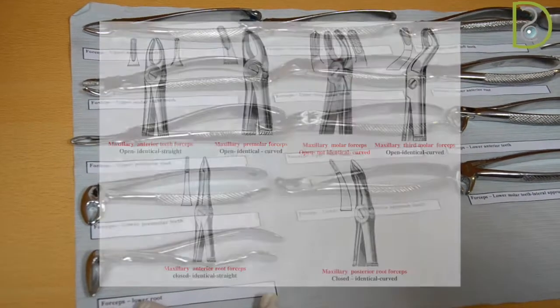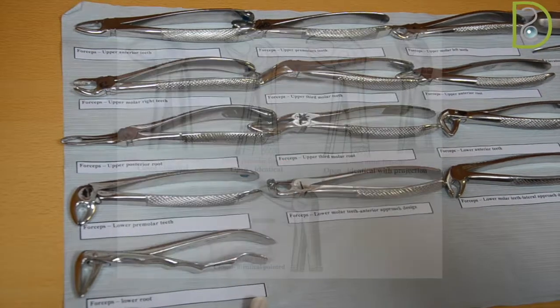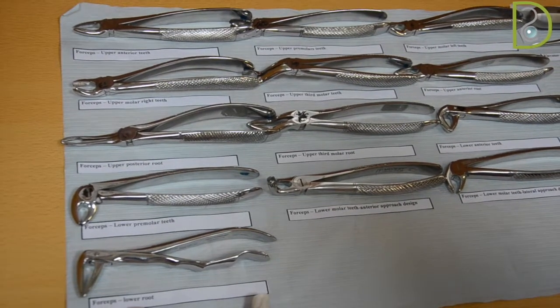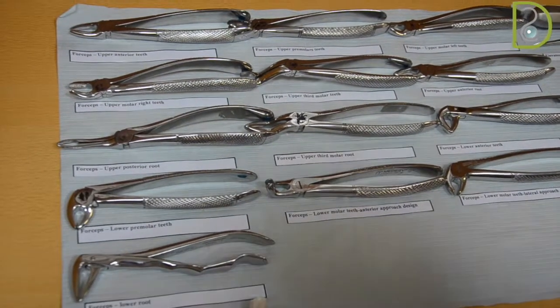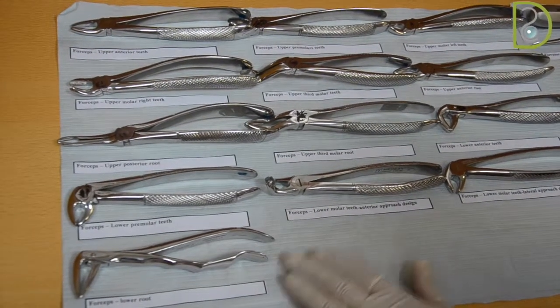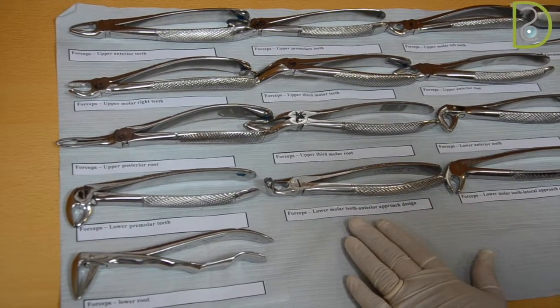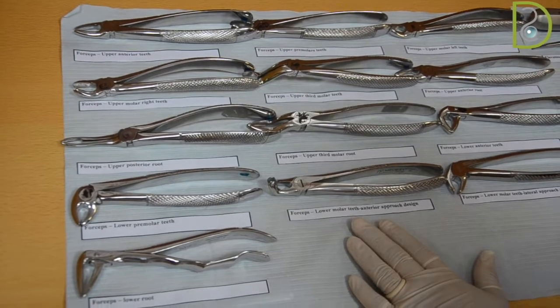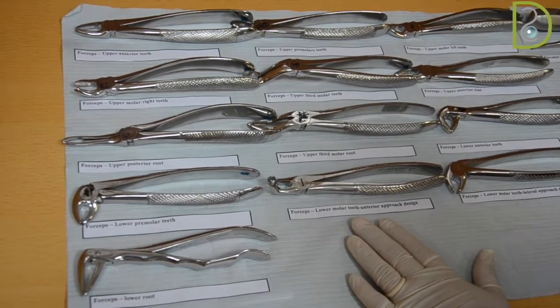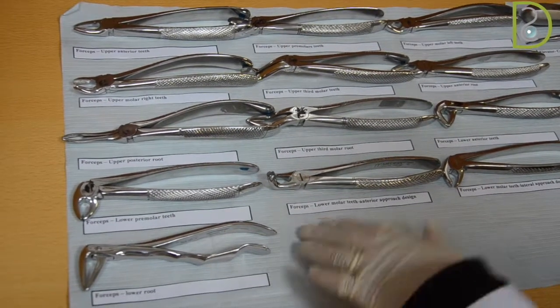Hello students, and welcome to this session to demonstrate surgical instruments used for extraction of teeth. Most closed technique extractions are going to be done by majorly these instruments, but not limited to these instruments. We have two kinds of instruments that are used for extraction.